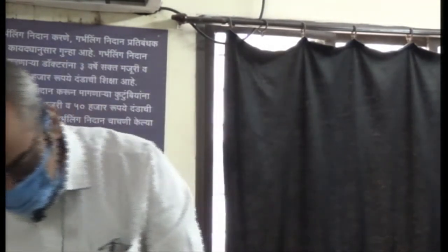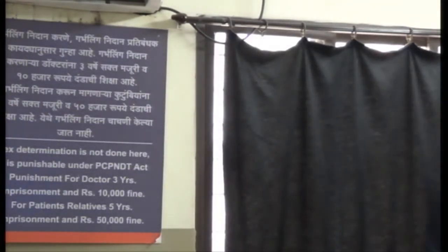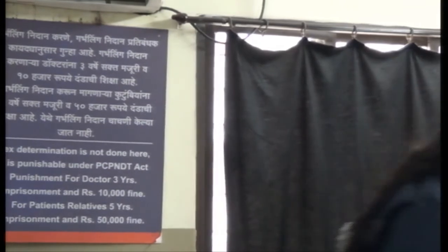So with this we are done with the cases, and now we will move to the next part of today's session, that is the renal Doppler. We will have a short presentation on renal Doppler basics, and then we will have a demonstration again.